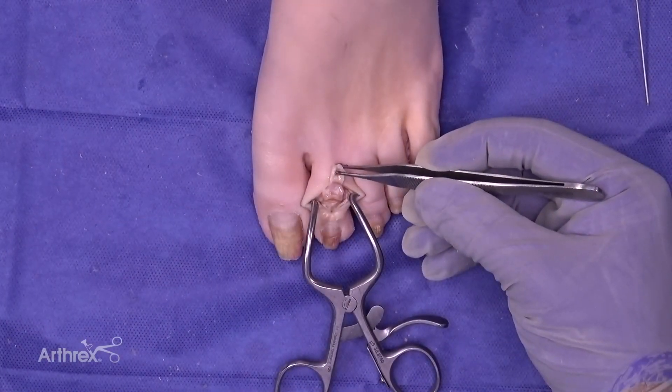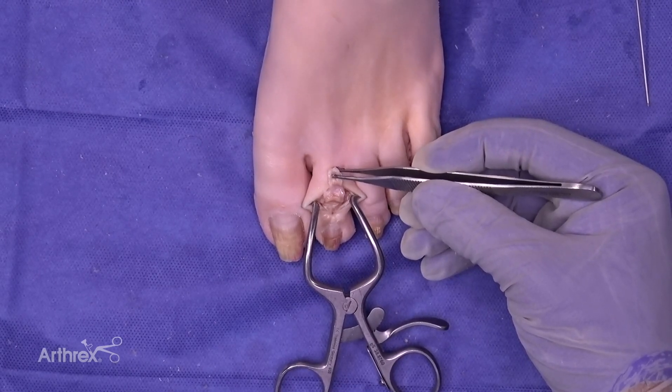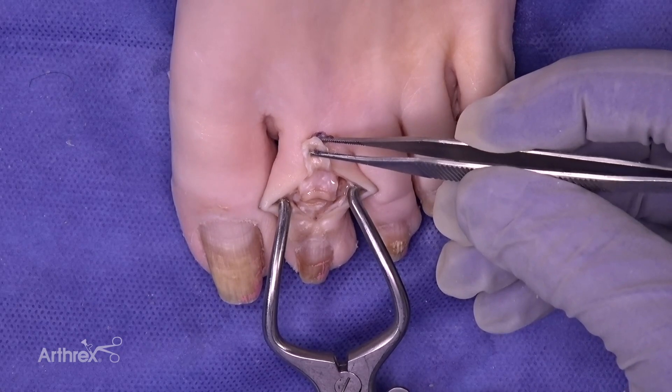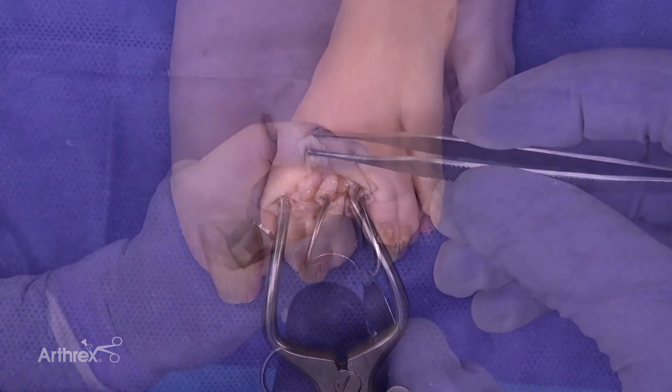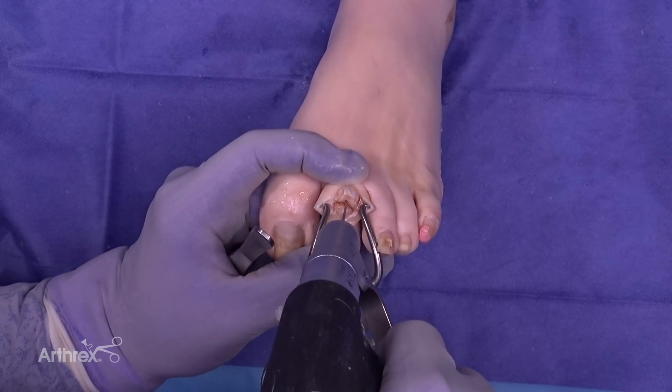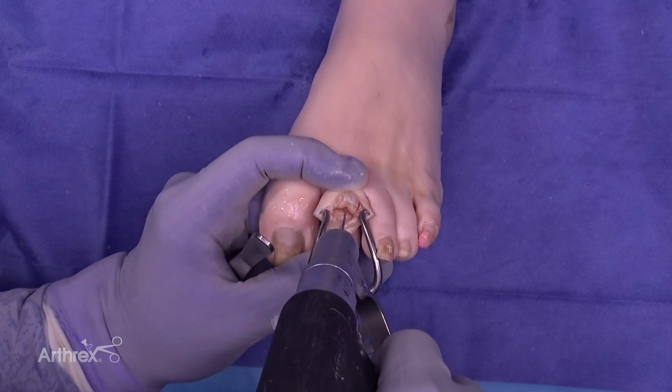Standard dissection for a hammer toe repair has been performed. We removed the collateral ligaments and now we're ready for bone prep. We're going to place a wire for our cup and cone reamers right down the central aspect of the head of the proximal phalanx.